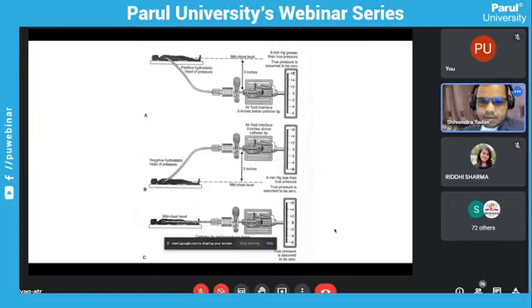Now if you see this diagram, at the top, the pressure transducer is located lower than the mid chest level, and hence there is a positive hydrostatic head of pressure. You will get a higher pressure because the fluid is creating a pressure going down because of gravity, at least 6 mmHg higher.